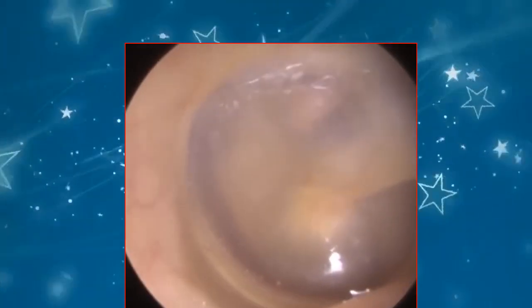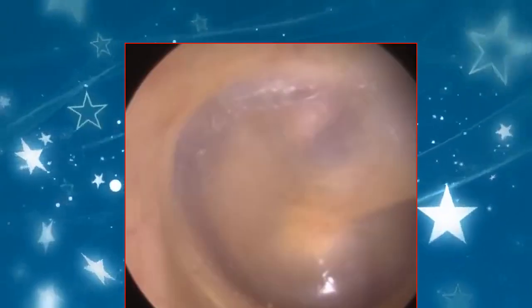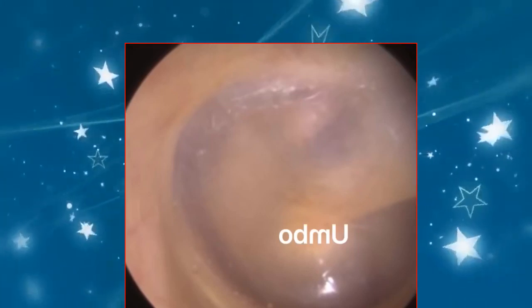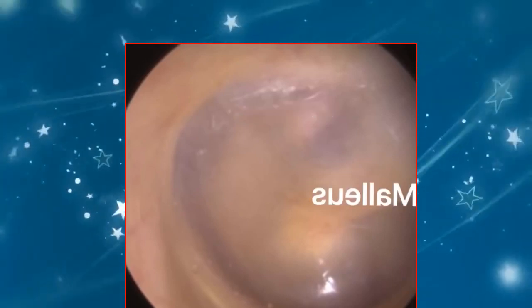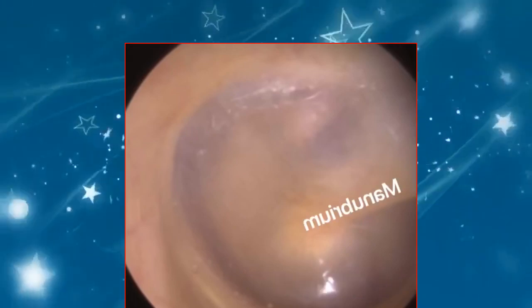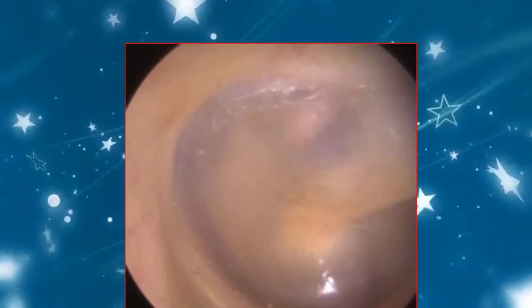And you can see the annulus there. So the annulus is the white ring around the circumference of the eardrum, and that's a fibrocartilage. It almost acts like a tent, where the tent hooks pull the strings down on the tent to give it rigidity, and that's what the annulus does. The annulus can run from 9 o'clock to around 3 o'clock around the periphery of the eardrum, and it's a thick white fibrocartilage, and it's almost pulling the eardrum down, giving it rigidity.